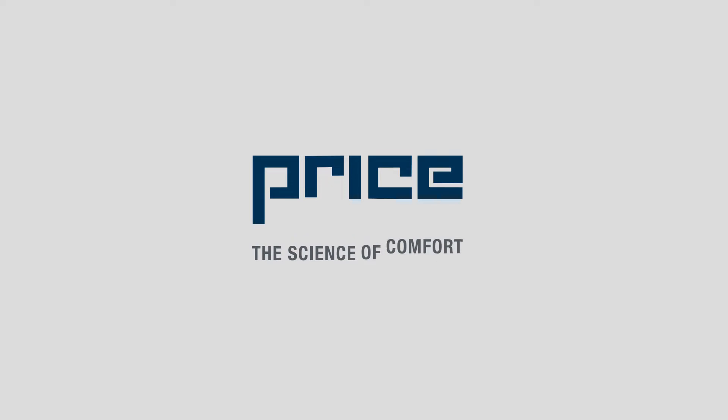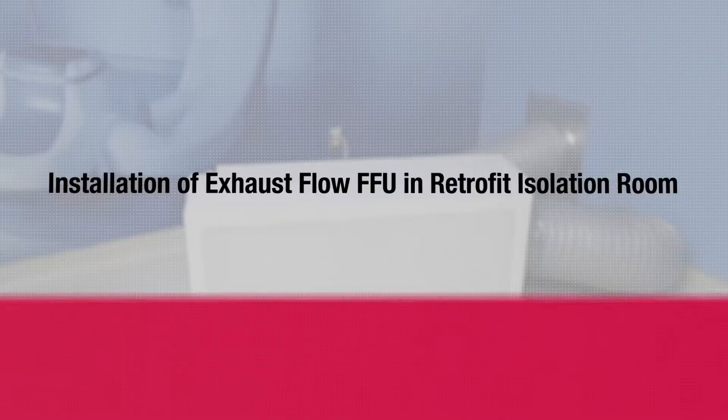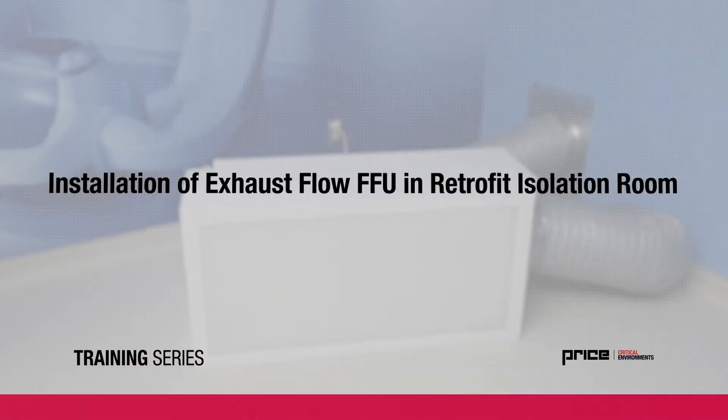This video will take you through the procedure for installing an exhaust flow fan filter unit in a retrofit isolation room application.